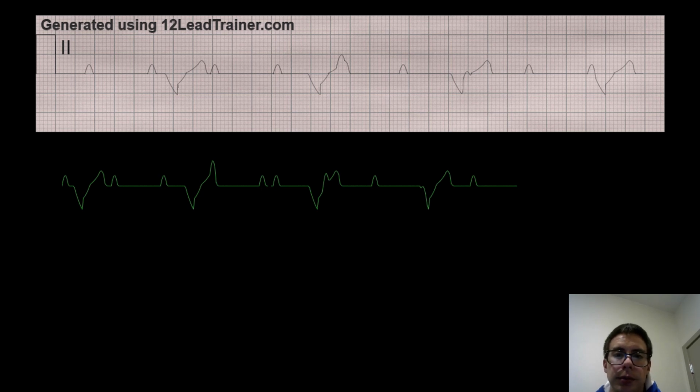So from here to here, that distance right there, we'd draw this on a piece of paper again, and then we'd move it over to the next one, but we'll just have to visually guess from there to there. So does this distance seem equal to that distance? Yeah. So then we'd continue to measure them all out. That seems the same.